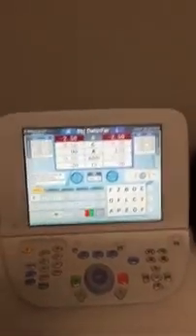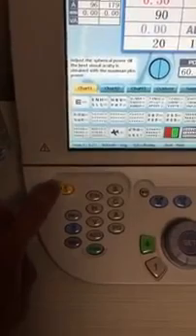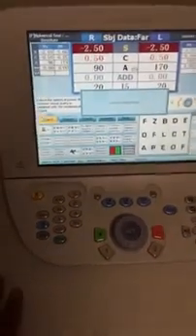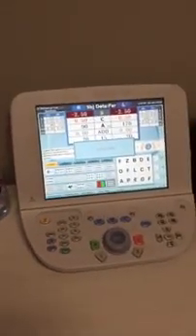If they don't, the first thing that you need to do is clear out whatever information is here just by pressing this clear button, CL. What that'll do is, you're hearing all these lens changes from the Phoropter unit behind me, it's just clearing everything out.